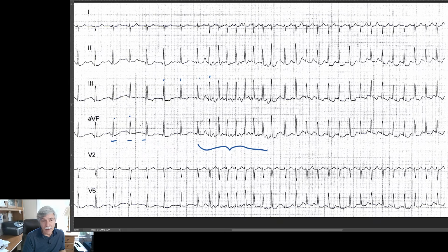And how do I know that? Well, the trick is to look at the prior ST-T wave and compare it with the ST-T wave just before the first beat of the tachycardia. So this is beat number 1. And what you see is this very tall, spiky signal that causes the T wave to be much taller than the previous T wave.